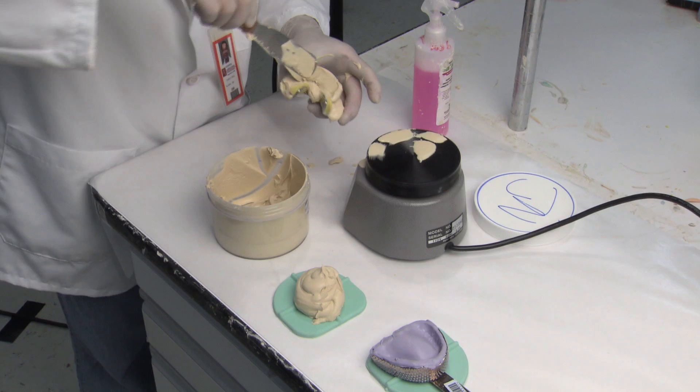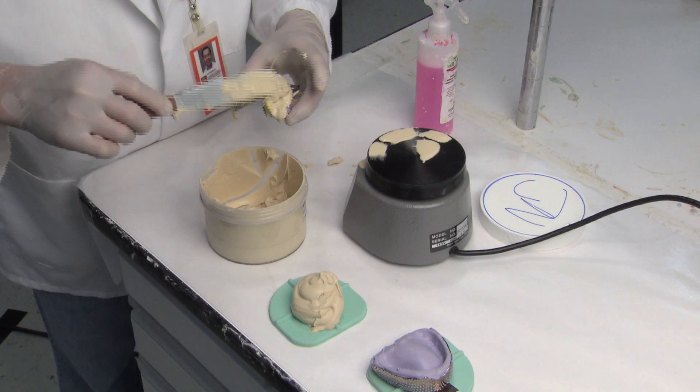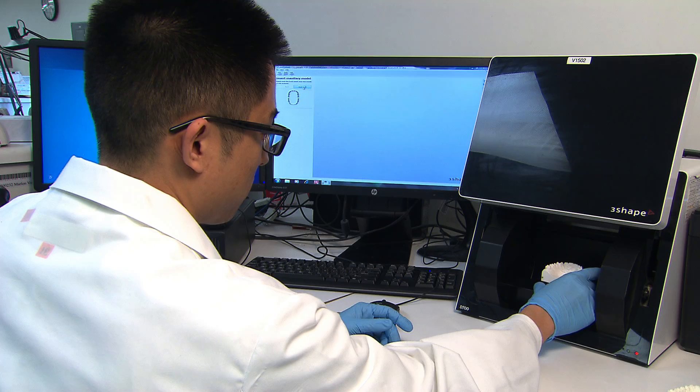Once we receive an impression from the doctor, the case goes to the plaster department for both a master and duplicate model to be poured and based. The stone models are then sent to the thermoforming department.